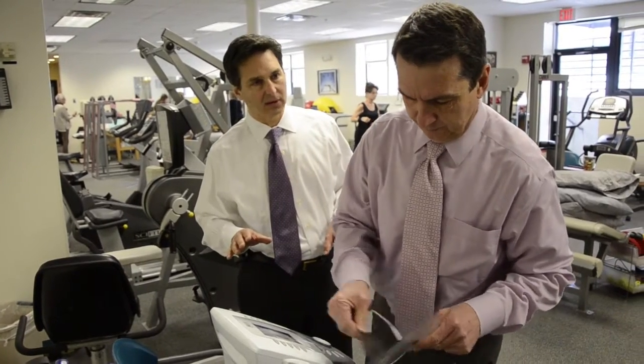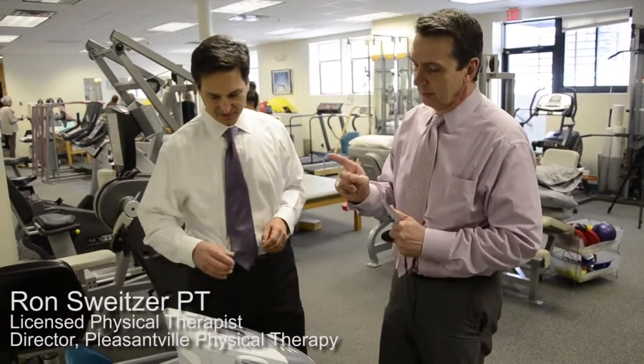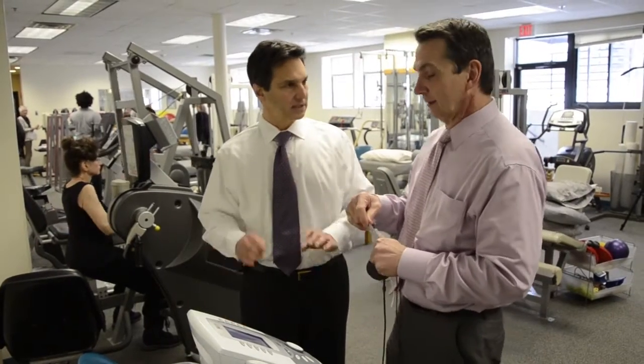This is a typical TENS unit — an industrial strength TENS unit. It's an electrical stimulation unit. Even though this is technically TENS because it stands for transcutaneous electrical nerve stimulator, no one in the clinic ever refers to this as a TENS unit. They always refer to the small portable units as TENS units. This is e-stim.